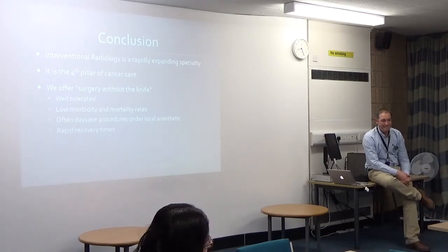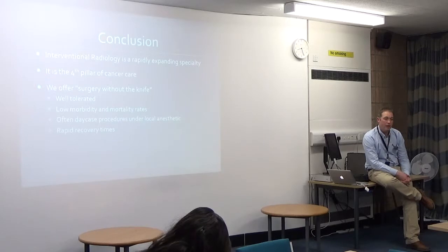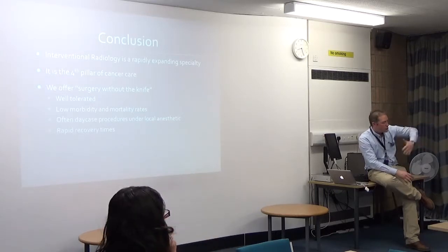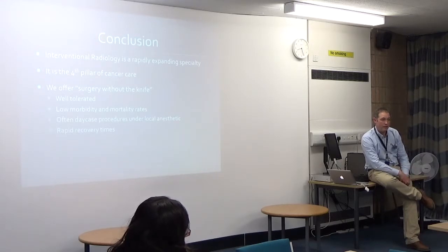Are the catheters reusable? No. What are they made from? Do you ever get kinks? I mean, this is quite a convoluted journey. Yeah, you can get kinks in the catheters. That's true. But they're all designed for the job, essentially, and we have stocks of them, so if one kinks, then we get another one. So we don't worry about it too much. They're not reusable. They're relatively inexpensive, and so they go in the bin after each outing.